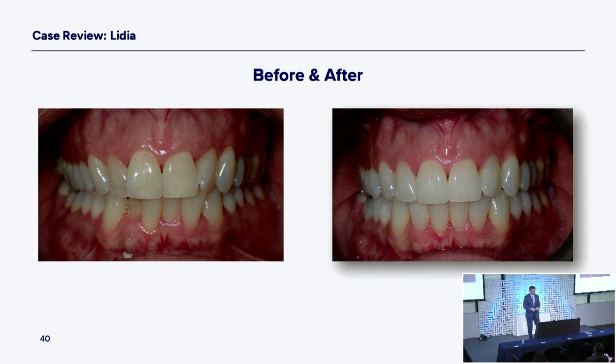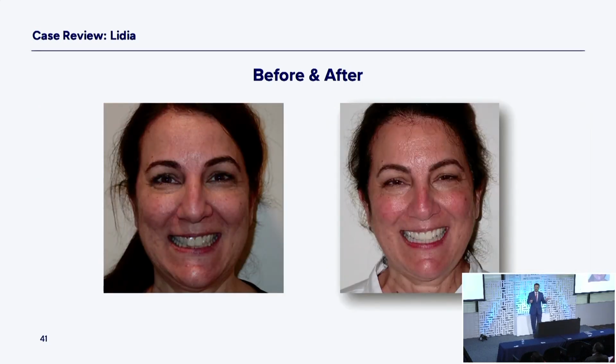And next thing you know, you've got this nice light effect. And your patient, happy smile. This is not veneers. There's no veneers, there's no bonding. It's just the whitening gel. 2 weeks at the beginning, 2 weeks in the middle, 2 weeks at the end. And that is priceless for you because guess what they are an addict of now? Whitening gel addict. So you have created the whitening gel addict.